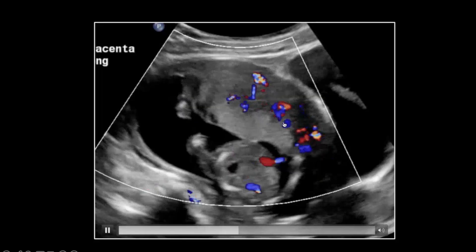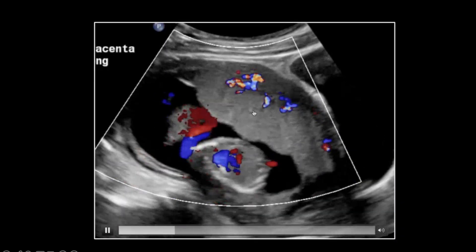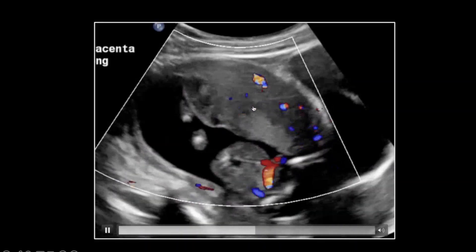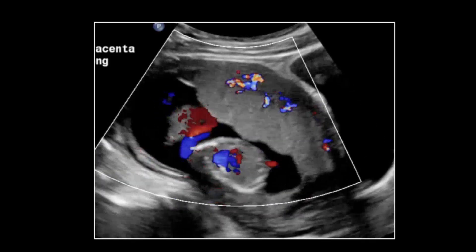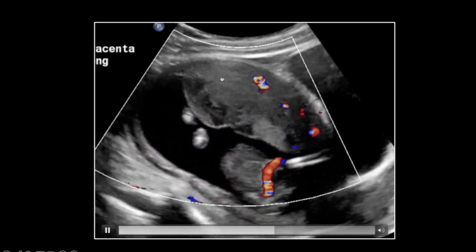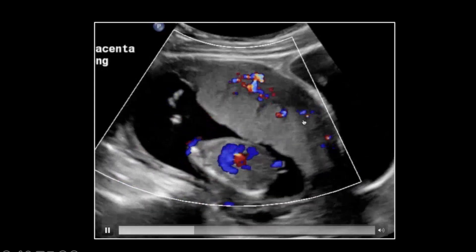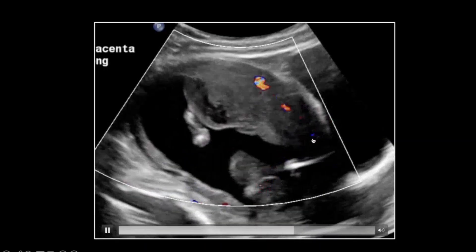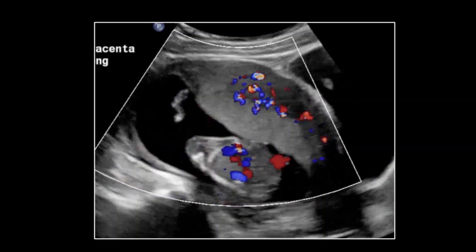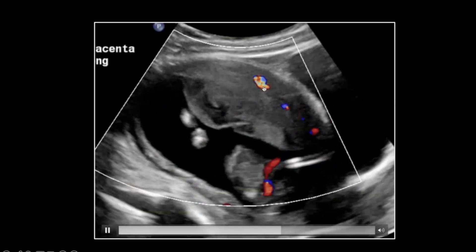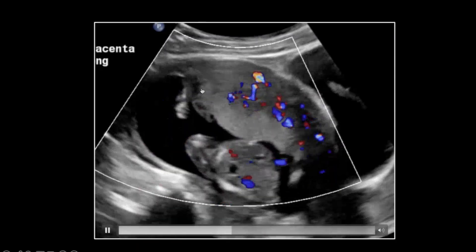Look at the undersurface of the placenta right there. This is a placental abruption. You see the irregularity on the myometrial aspect of the placenta — it's all irregular and indented, full of fissures, looking ratty as though it's been pulled off. This is all hemorrhage in here, and there are a couple of spots of active bleeding within it. It's almost like a ring of fire — look at all the hemorrhage along the detached aspect of the placenta. When you see undermining hypoechoic material like this, that's when you start thinking placental abruption.